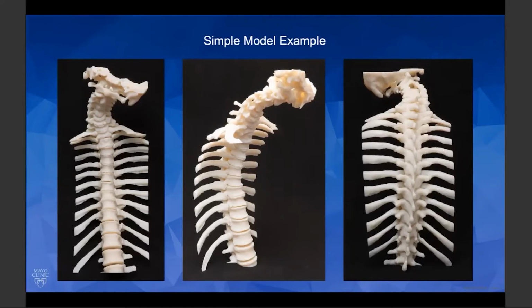We cannot fit a full-size adult spine on many printers that we have here at Mayo, so the Objet gets used for those that are larger and full size. We printed this model in a Vero White Plus material and a 706 support. The time for printing was 32 hours, 26 minutes, and we used 1,200-ish grams of Vero White Plus and 700 grams of support 706. All right, Nicole, we can go to the next case.